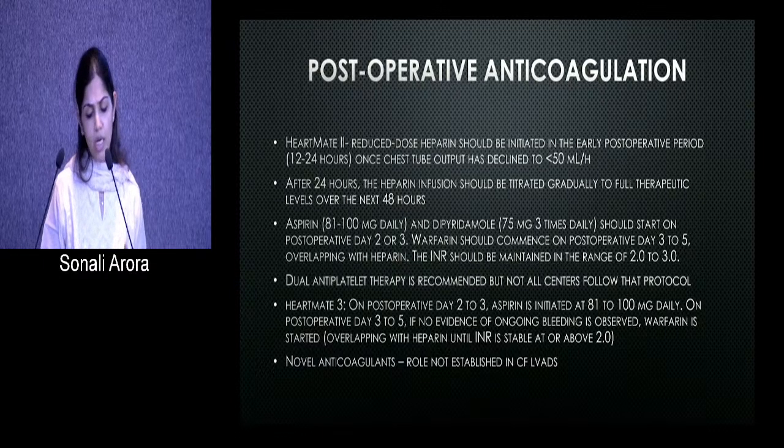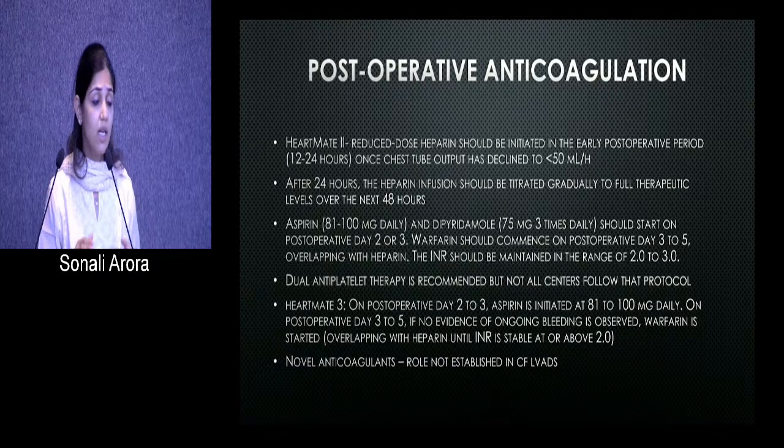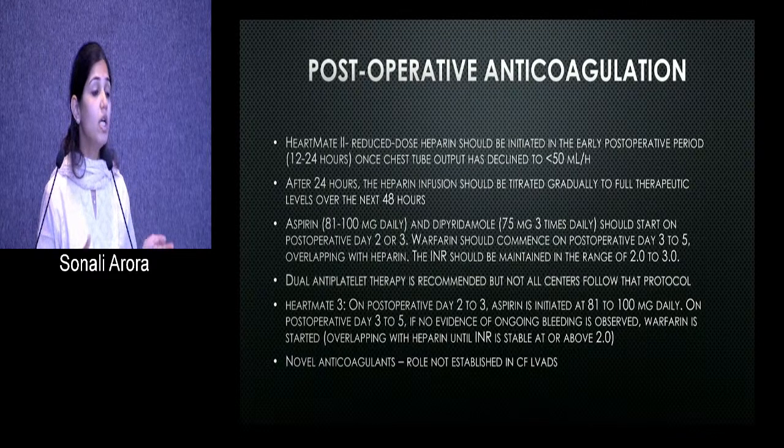With HeartMate 3, again on post-op day 2 or 3 you can start aspirin, and on post-op day 3 to 5, if there is no evidence of ongoing bleeding, warfarin is started overlapping heparin. The role of novel anticoagulants has not been established in LVADs. In HeartMate 3, the risk of thrombosis is lower than in HeartMate 2, so the anticoagulation is less aggressive most of the time.